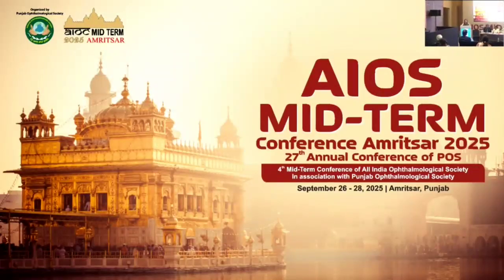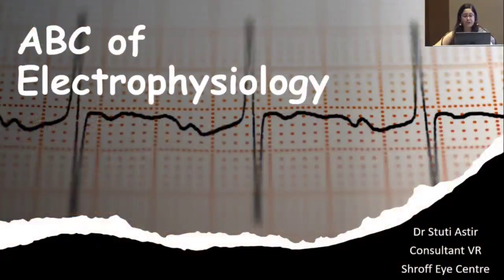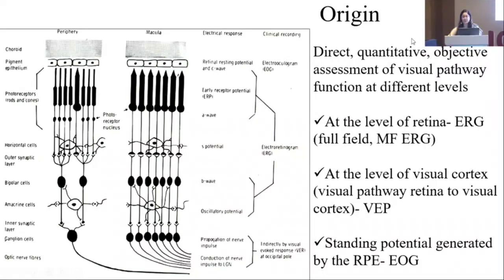Good afternoon. I'll be talking on the basics of electrophysiology. It is a direct, quantitative, objective assessment of the visual pathway at different levels. ERG is at the level of the retina, VEP at the level of the visual cortex, and EOG at the level of the RPE.